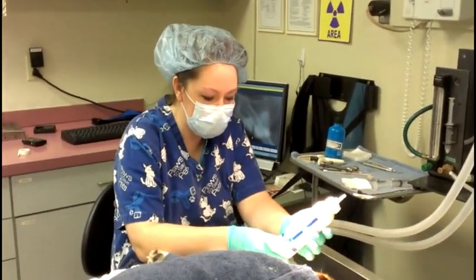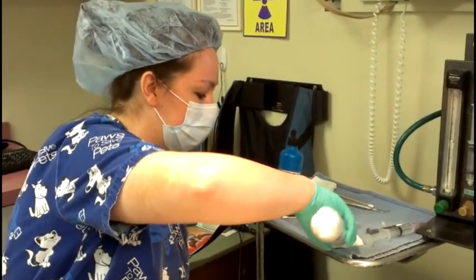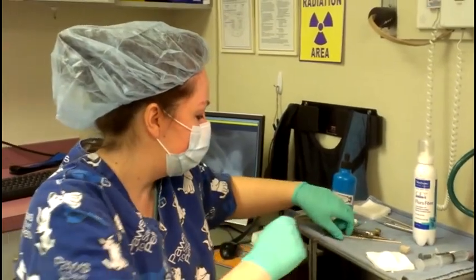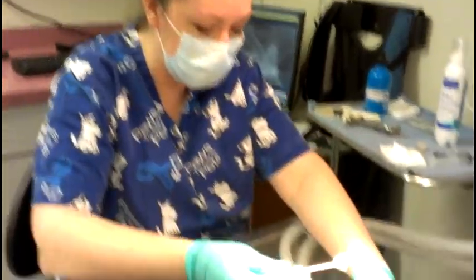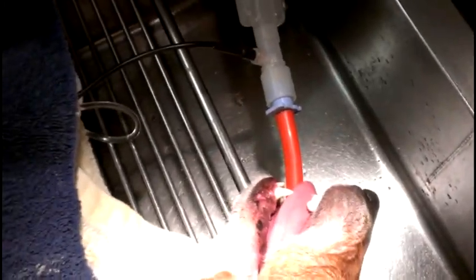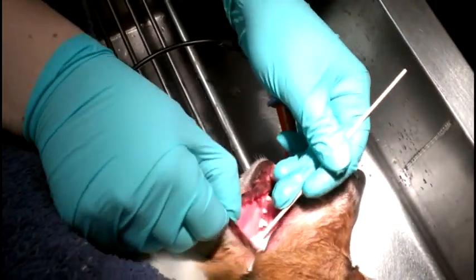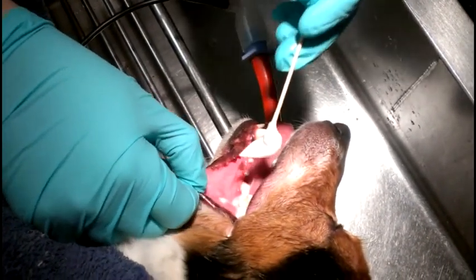The last thing we're going to do is put on some fluoride foam. What that does is it helps to strengthen that enamel, keeps bacteria from wanting to stick, and helps prevent plaque and tartar formation. It's just like a mousse. We just paint that onto the surface of the teeth, and it's going to sit on there for about 3 minutes. This product also has a really nice cherry scent, so it makes their mouth smell wonderful.